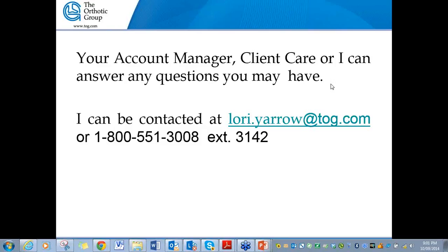Those two pictures, then, they can just send them to the printer, email them to themselves and print it off. That's measurement of the foot.